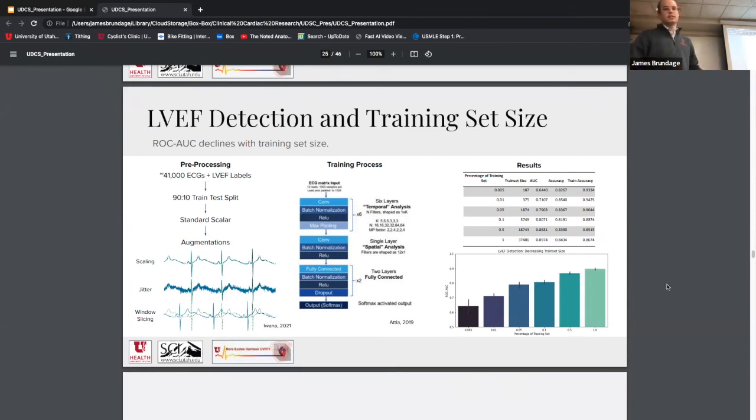And this was an exciting first step for us. And so we realized, okay, hey, we can do this. We've replicated this clinically impactful model. And so from there, we started talking about other projects that we wanted to start working on and quickly realized that all of the projects that we were really excited about were going to require us to use relatively small data sets, for examples where we might only have 100, 500, 1,000 examples compared to our 41,000 that we used to train this model.